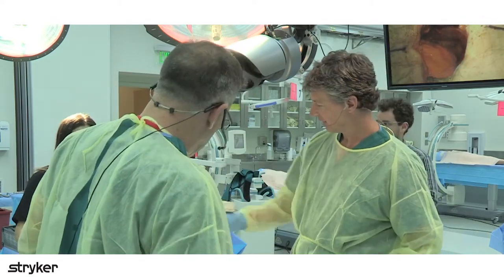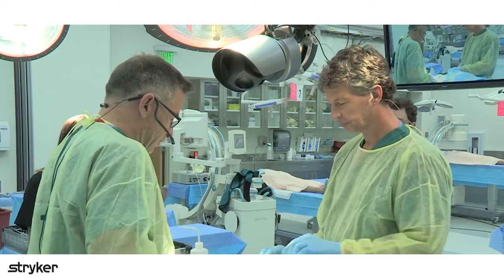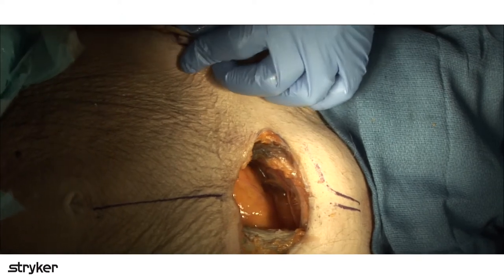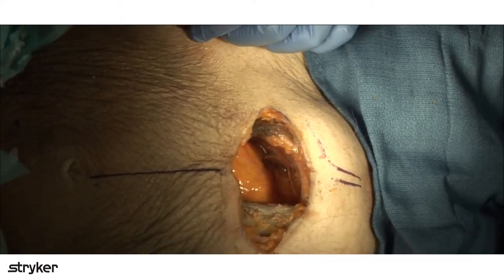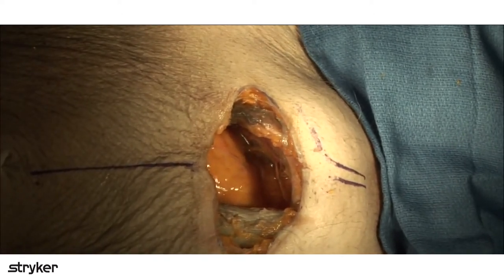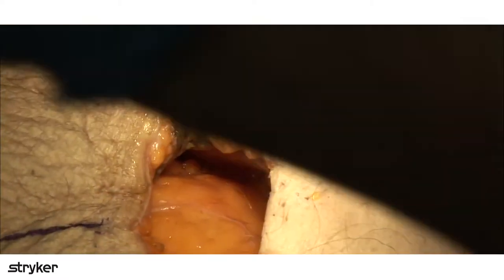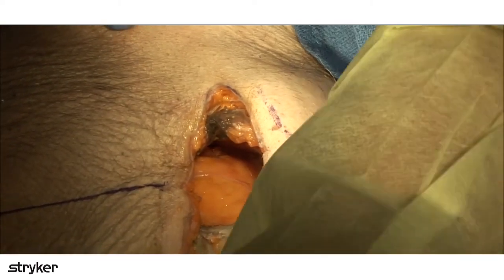Okay. So the standard lateral window is a pretty straightforward approach where you're basically coming down on the iliac crest from the ASIS, following the pelvic brim across up until a point, and you curve a little bit more cephalad at some point proximally where you end up coming through more muscle fibers.